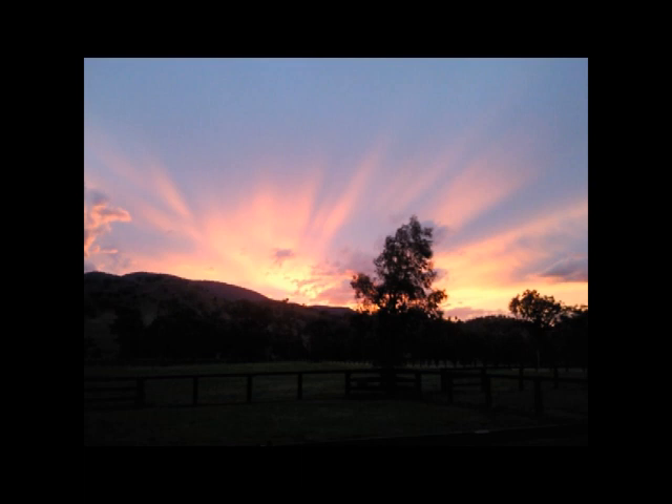We're at that time of year where the season's fast approaching, and we check all the mares to make sure they're still in foal, and to check the health of the placenta and of the fetus. I just have a few clips of the images we took this week from some of the mares.